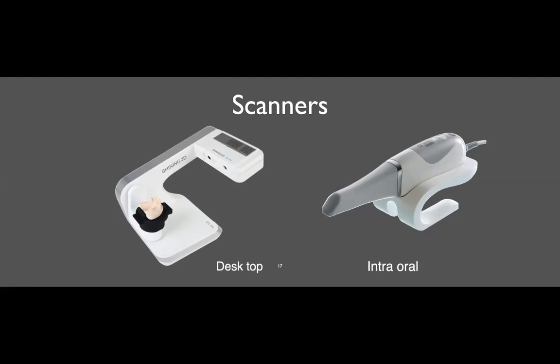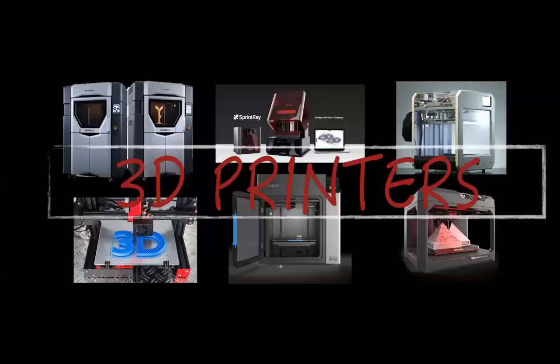So you guys do this routinely, so that should be of no issue. And then obviously, at the end of the day, to plan the case and print your guide, you need software to create your guide, and once you have it on that software, you create an STL file, and then you send it to a 3D printer.